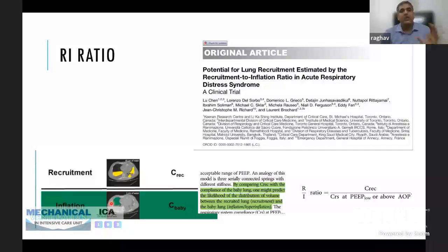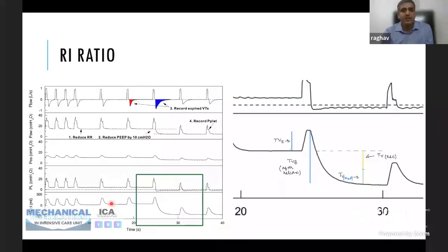This maneuver can be done on any ventilator at the bedside. For this, we require just 2 minutes and a very simple maneuver, which includes decreasing the PEEP suddenly from a high level, for example 15 to 5, a difference of 10. This sudden drop in PEEP will lead to release of the trapped volume, which is causing inflation or recruitment at the level of PEEP of 15. And this volume is measured by the ventilator in the next breath.